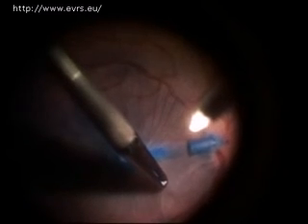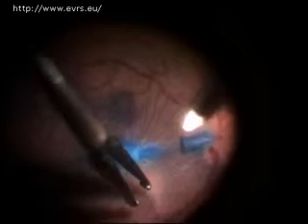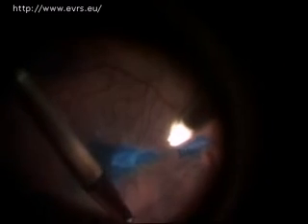After trypan blue staining and ILM removal, it was noted that the membrane spreads under the fovea. These observations suggest another entry site for blood, which is probably both sub- and epiretinal. In this patient, 1 out of 50 visual acuity was achieved.